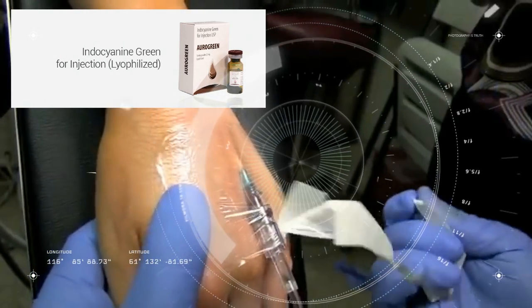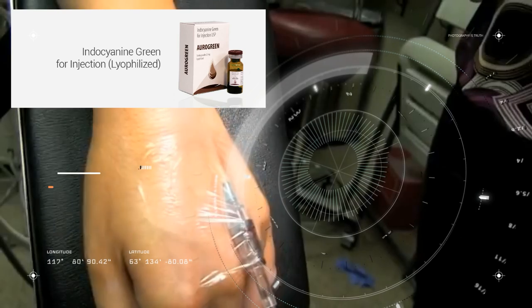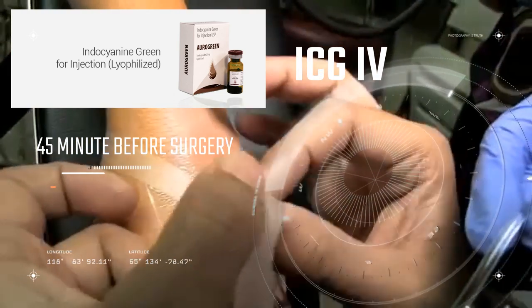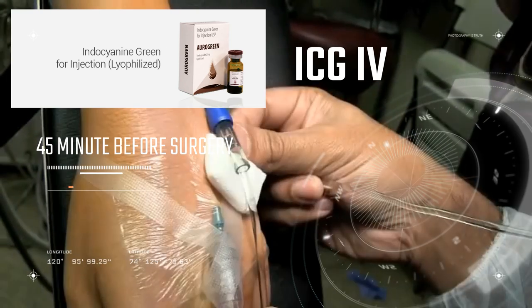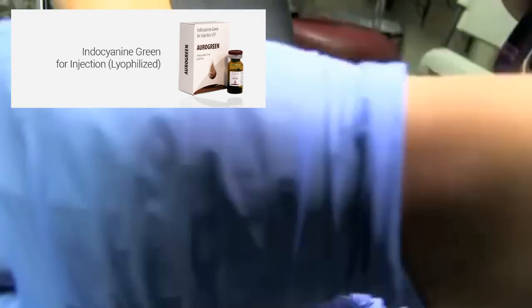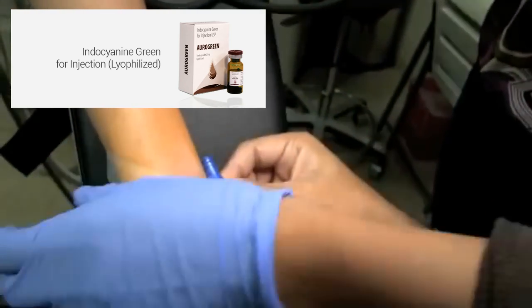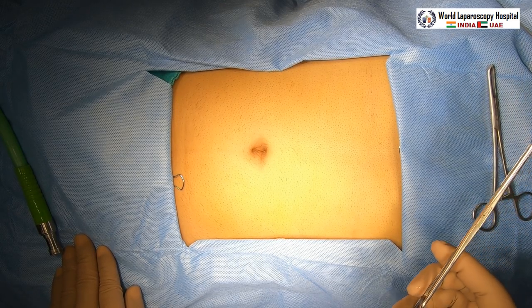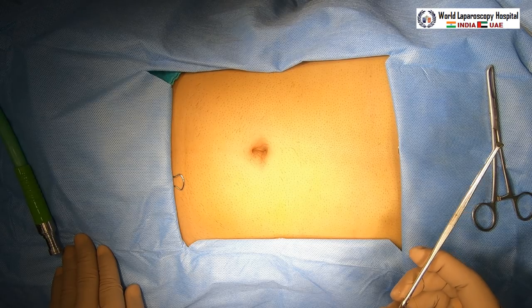You can use the same IV cannula for the infusion and for the fluid, and after that you can fix the cannula so the patient doesn't need another prick. Now we go to the OT where the patient will be anesthetized. We are using nitrous oxide and isoflurane anesthesia.